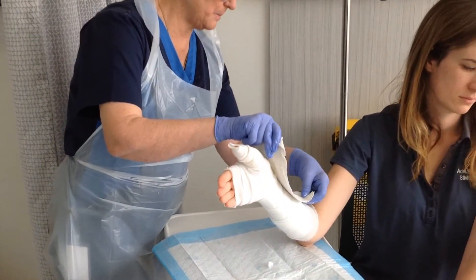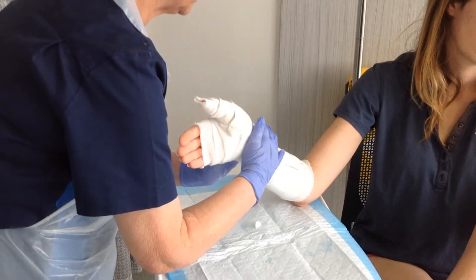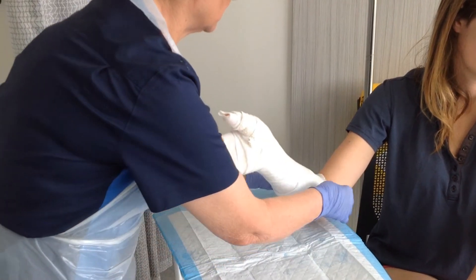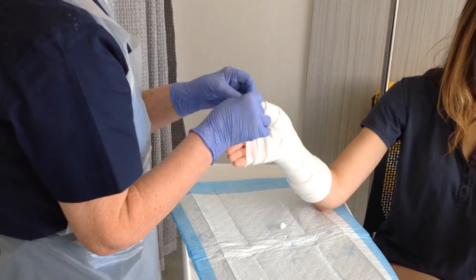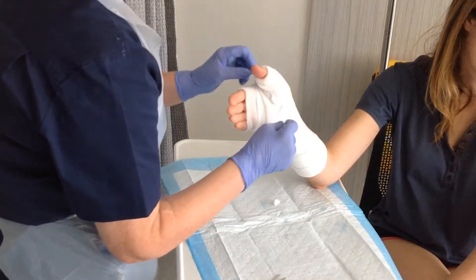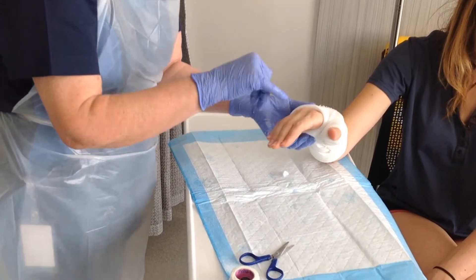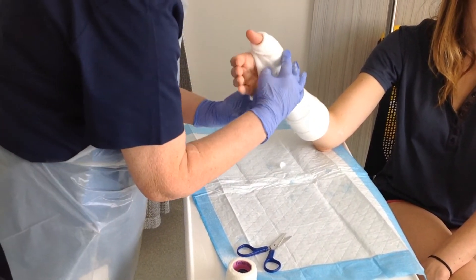We then take the slab and apply it onto the radial aspect of the arm. Just smooth it down with the flat of your hands — no fingers; if you put your fingers into it you'll leave dents. Fold the edge up like so — that's one like that for the thumb — and then bring this down to the palmar crease, making sure the metacarpal heads are free so that the hand can have gentle range of movement exercises.